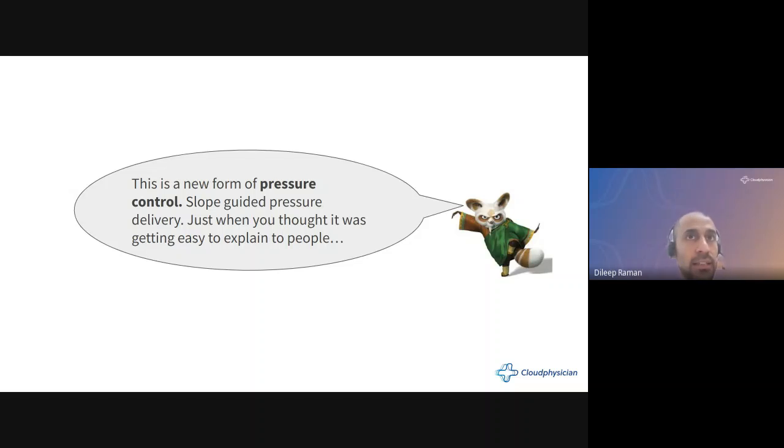So Draeger Savina is a very, very common ventilator. It's there in many, many places in India. And just when we thought that the label volume control is actually what the ventilator is trying to do, if you really analyze the pressure waveform, it's actually pressure control. So the three of us were now wondering, how do we go about figuring out the intricacies of this?